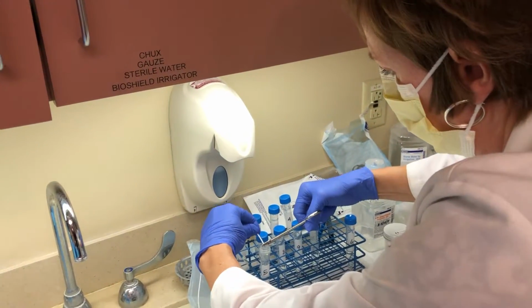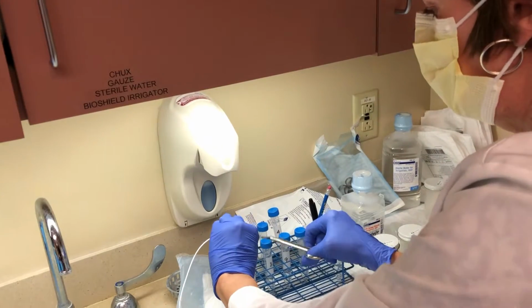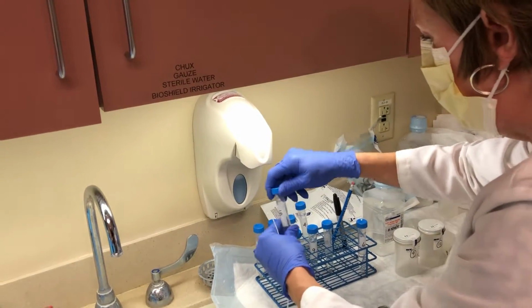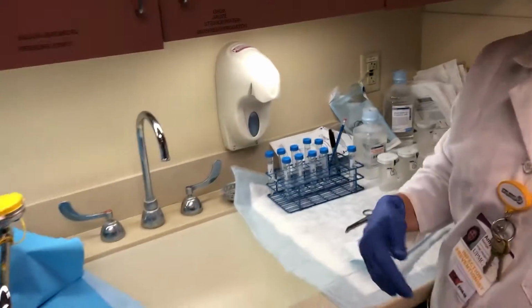You see that, Brandon? I can. Okay. It's important to insert the brush down into the tube because if you're not careful, it can fly off and then you've lost your specimen. So if you can snip it off down close to the inside of the tube, it will help prevent losing your specimen. So we've done our brush.